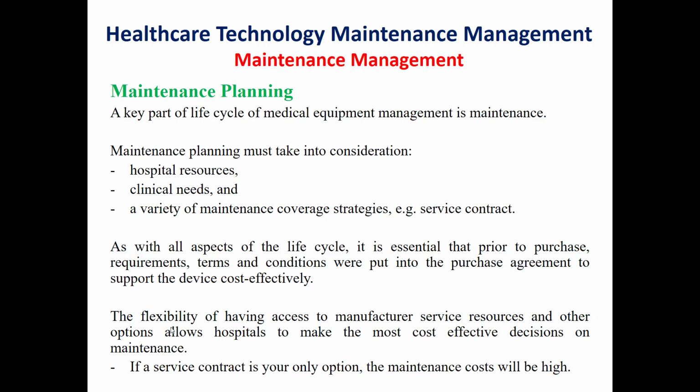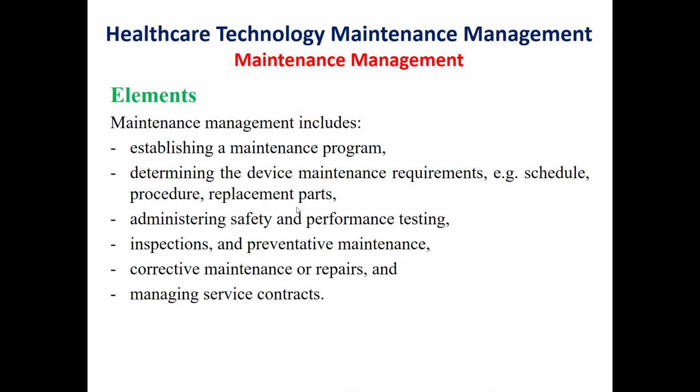Also, another point is the flexibility of having access to manufacturer service resources and other options. This will help hospitals to make the most cost-effective decisions on maintenance. Because if we have only a service contract, the maintenance costs will be high.